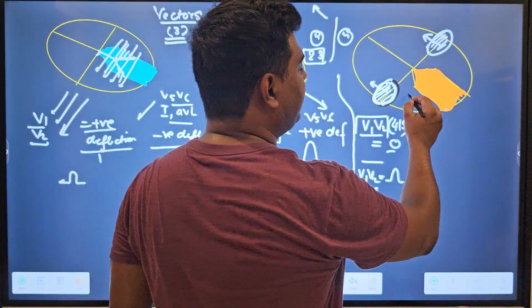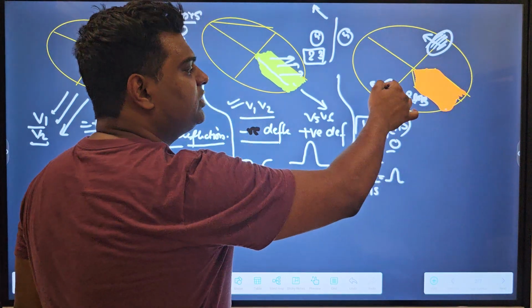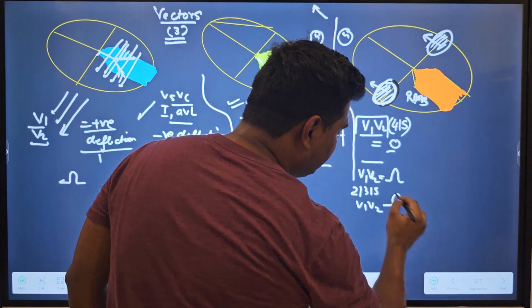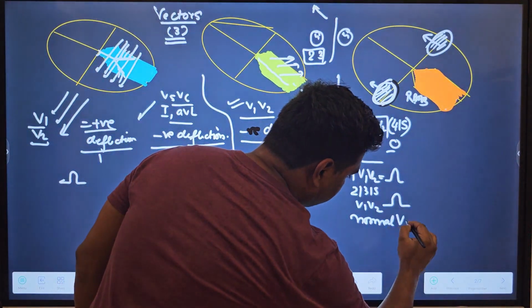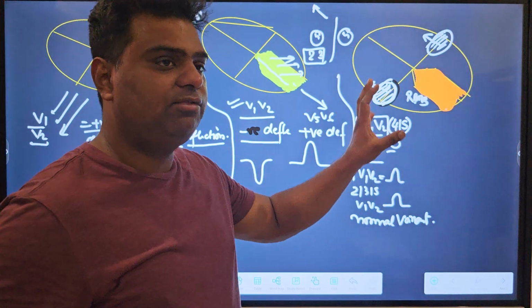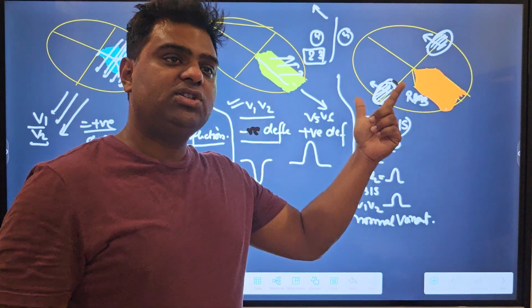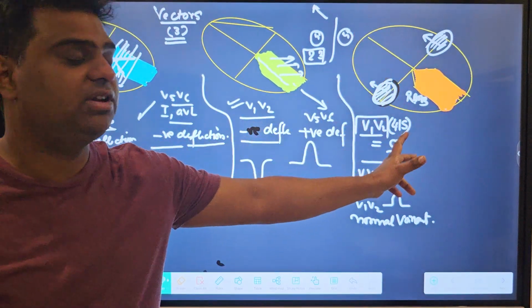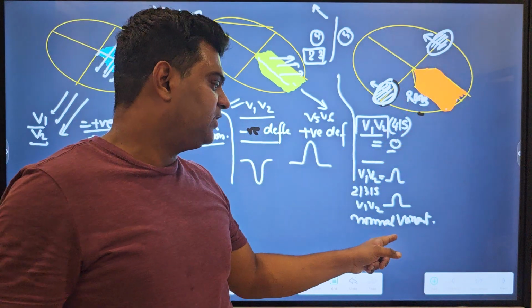If there is a right bundle branch block, this right side of the ventricle will now be depolarized from the left side, so this wave will be very slow. In that case also V1, V2 will record a positive deflection like this. And a third case, it can be a normal variant. The gist is that normally V1, V2 in the fourth intercostal space are not able to measure this depolarization vector of the base because it is beyond their scope, and it is very fast. So the causes when V1, V2 can record this depolarization wave as a positive deflection are: if they are misplaced, if there is a right bundle branch block, or if there is a normal variant.